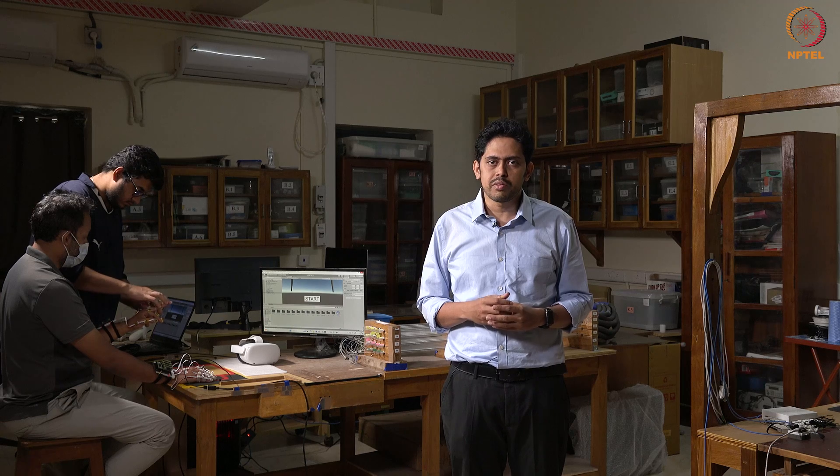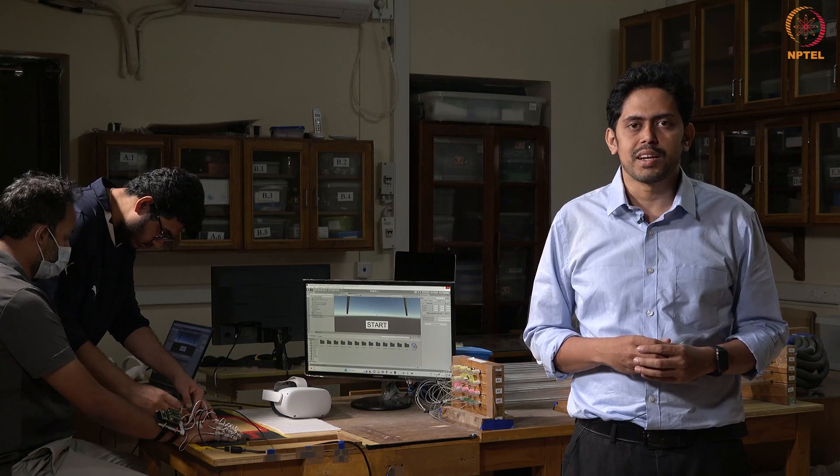With this, we come to the end of this video. In this video, we saw a live demonstration of the full hand kinematic measurement system using 16 IMUs. We saw the construction, we saw the working, we also saw the method of attachment and an animation using MATLAB Simulink and Unity software. Thank you very much for your attention.